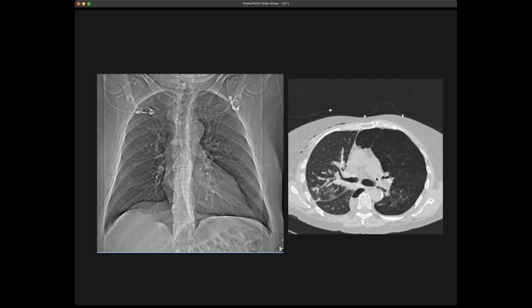So with these CT scanners, what they do is first a kind of scouting scan. If I take my CT scanner and, instead of letting the source rotate the whole time, I stop the source but move the table, so the patient slides underneath the source, and I measure and look at the projection, then obviously you have a classical X-ray scan. So with a CT scanner, you can make a classical X-ray scan, and that's what they do first.